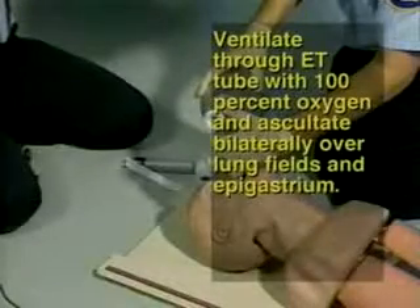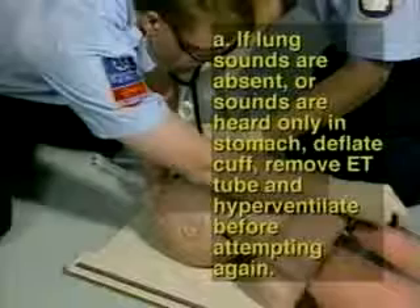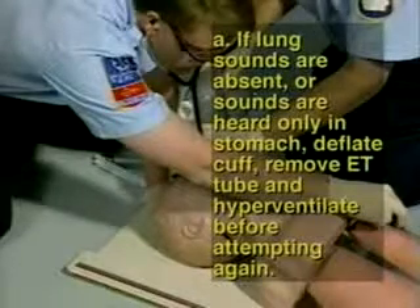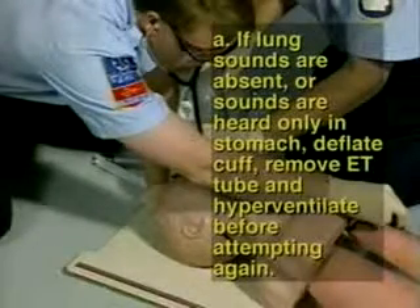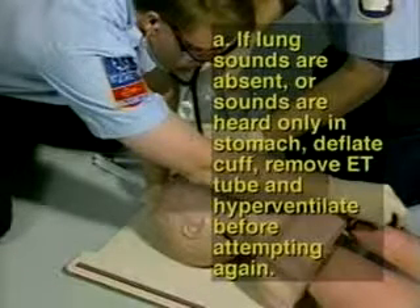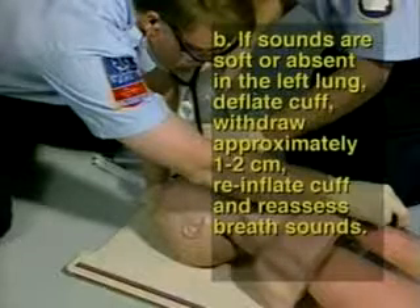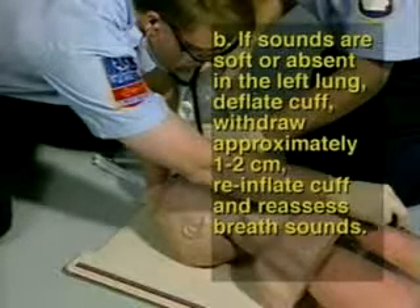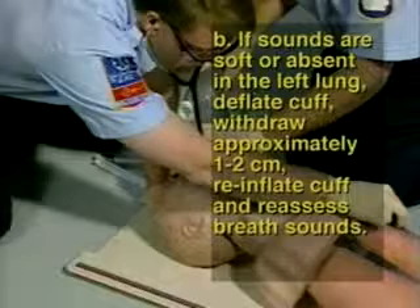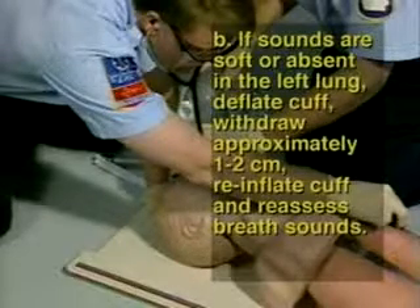Step 17: Ventilate through the ET tube with 100% oxygen and auscultate bilaterally over lung fields and epigastrium. If lung sounds are absent or sounds are heard only in the stomach, deflate the cuff, remove the ET tube, and hyperventilate the patient before reattempting intubation. Step 18: If sounds are softer or absent in the left lung, deflate the cuff, withdraw the tube approximately 1 to 2 centimeters, re-inflate the cuff, and reassess breath sounds.